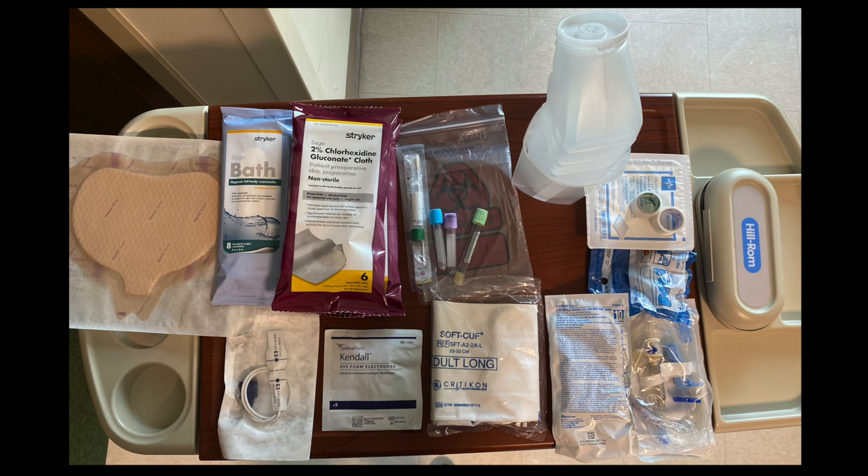The first thing that I do is I gather all of the supplies. These are the basic supplies that I grab: a Mepilex, bath wipes, chlorhexidine wipes, materials for lab, a urinal, and also a liquid measuring container. I always like to have gauze in the room and tape, pulse ox monitor, telemetry leads, blood pressure cuff, IV tubing, and swab caps. I also gather an ambu bag and the items to set up suction, which I will show you in just a minute.